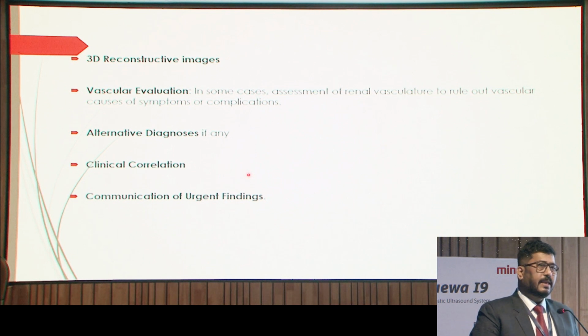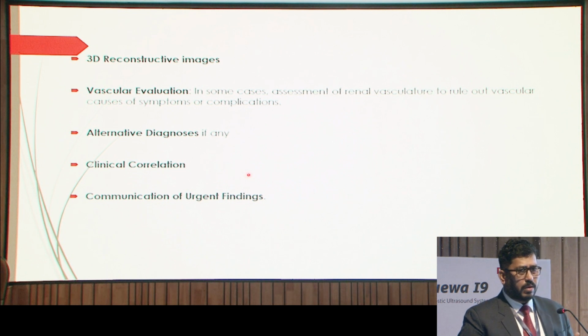In some cases like anomalous kidneys, like pelvic kidney, ectopic kidneys, horseshoe kidneys, vascular evaluation should be done even without asking, because in surgical planning we need to know the vessels around the kidney.